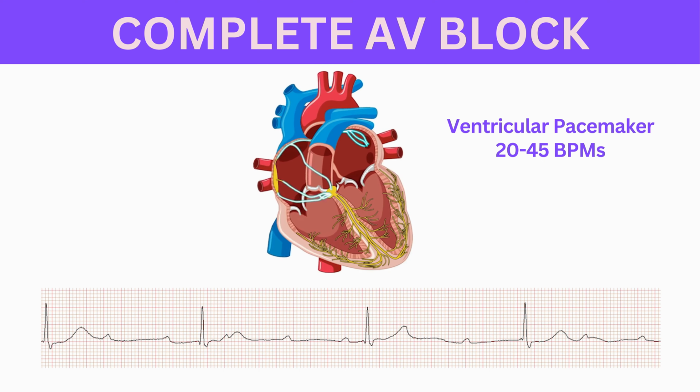That wraps up our segment on arrhythmias. And yes, that was a lot at once. But feel free to repeat this section, and to help, here's an arrhythmia chart to help your arrhythmias stay organized.